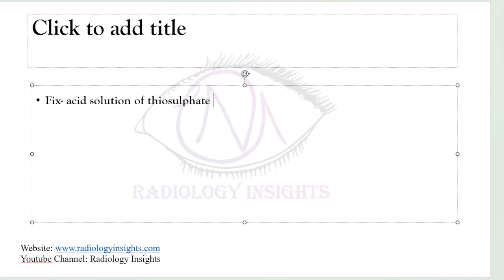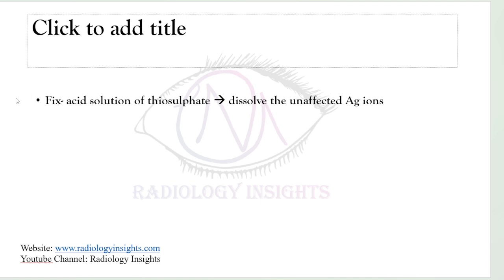This acid solution of thiosulfate will dissolve the unaffected silver ions so that the image is stable and is unaffected further by light.